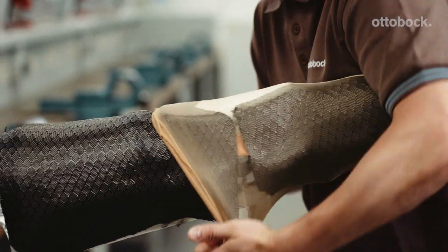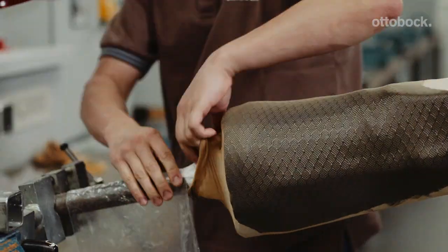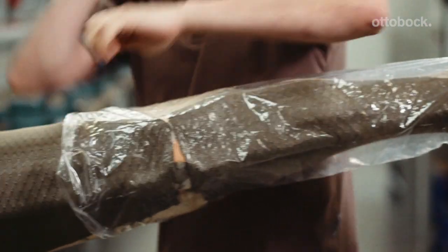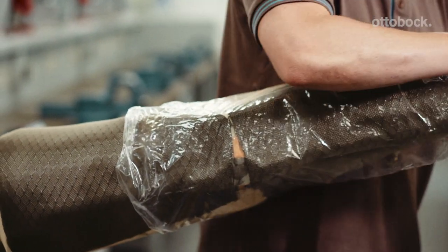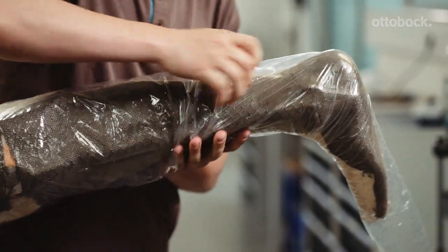Pull a Perlon sock over the model and protect the suction tube with several layers of Perlon stockinette to prevent contamination with resin. Pull a PVA bag over the model and connect the second vacuum.